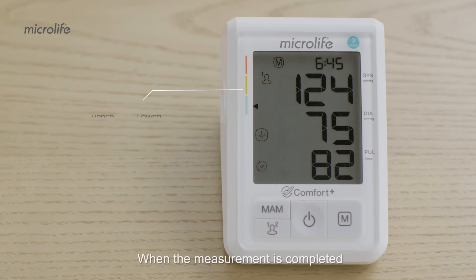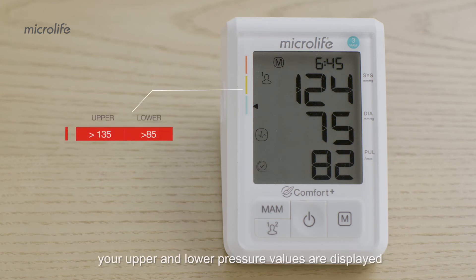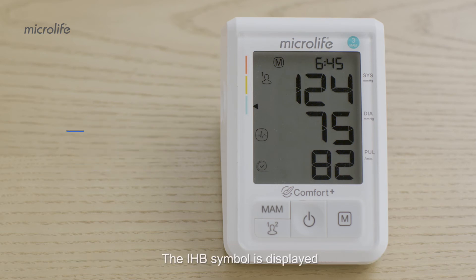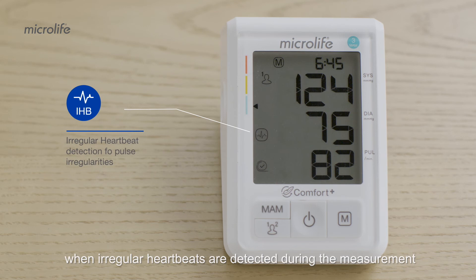When the measurement is completed, your upper and lower pressure values are displayed and classified by the level indicator based on clinical guidelines. The IHB symbol is displayed when irregular heartbeats are detected during the measurement. Consult your doctor if IHB occurs frequently.